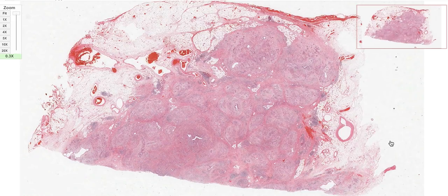So this time we are going to see a slide of pancreas. First, I'm not going to tell you how I said this is pancreas. We'll deal with it later. Now I'm having a disorder of pancreas which is having multiple rounded structures like this, right? You can see the multiple rounded structures.